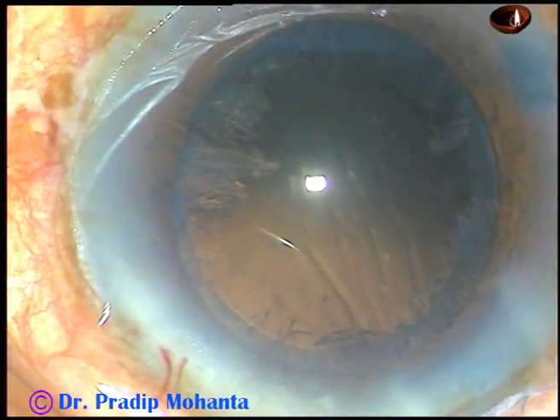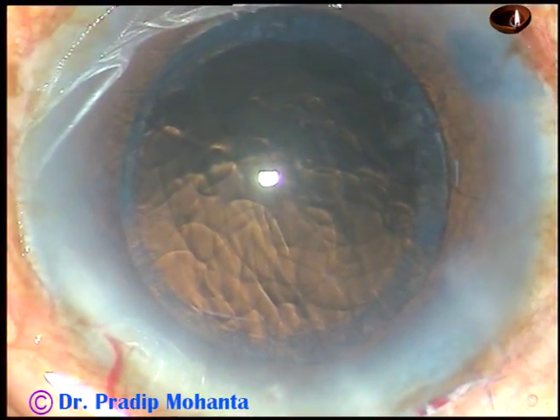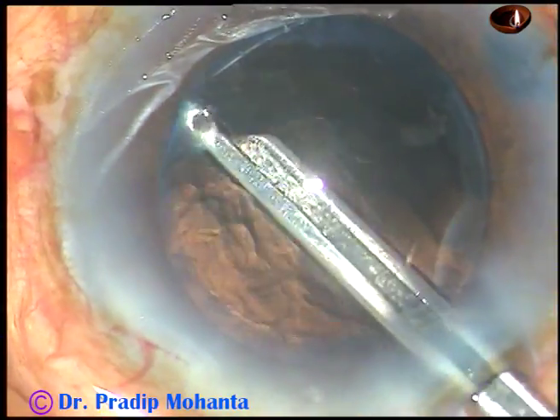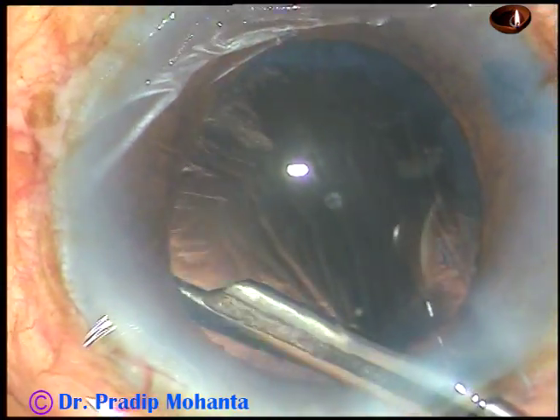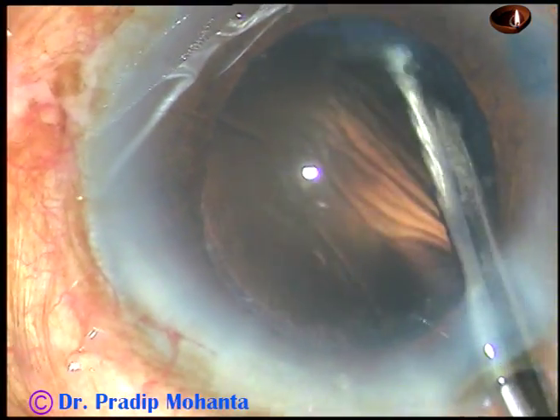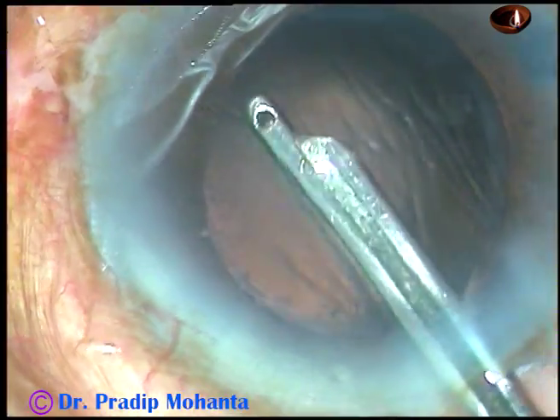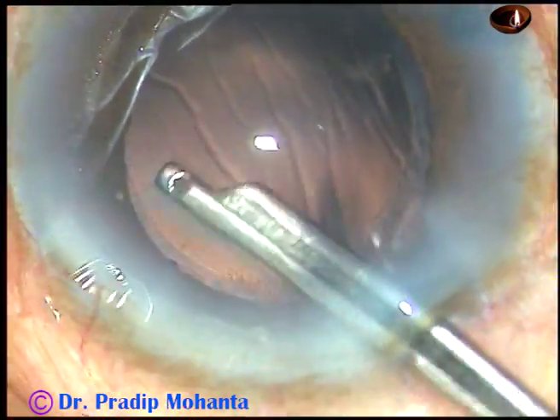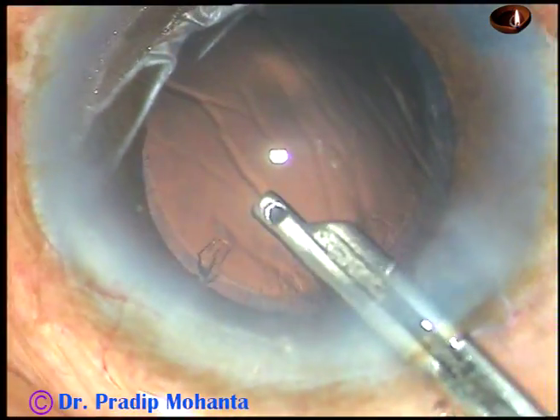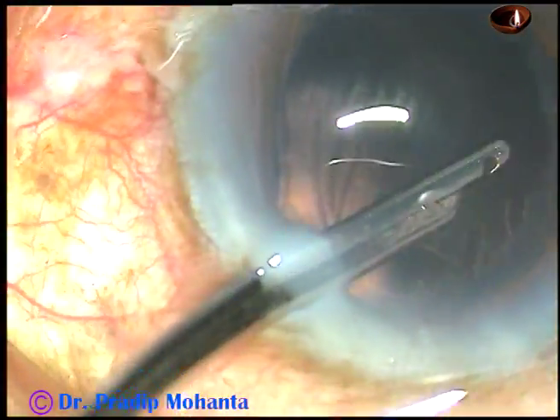Now I inject some viscoelastic substance, and this is the time to remove the cortical matter. Very little cortical matter is remaining. I am using a 23-gauge Simcoe cannula for removal of cortical matter — you can use a coaxial I/A or bimanual I/A for this. This is a totally unedited surgery and you are watching each and every step in real time.